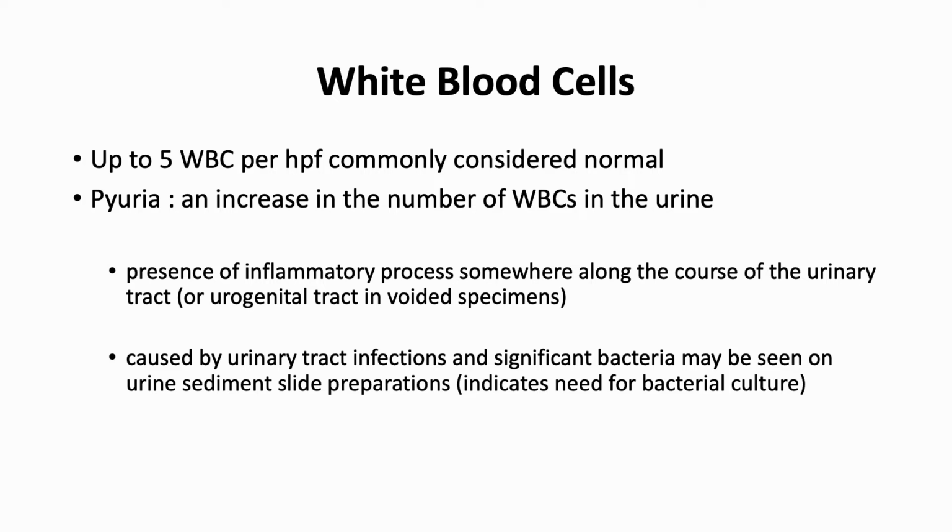Now, in urinary tract infection, a significant amount of bacteria seen on the urine sediment preparation can indicate the need for a bacterial culture. And these are the common causes of pyuria in association with bacterial infections: pyelonephritis, cystitis, prostatitis, and even urethritis.